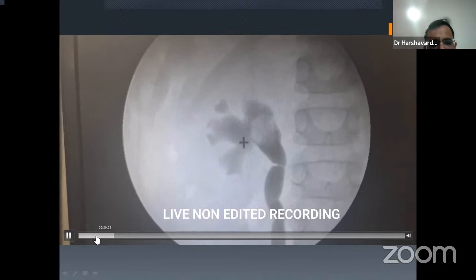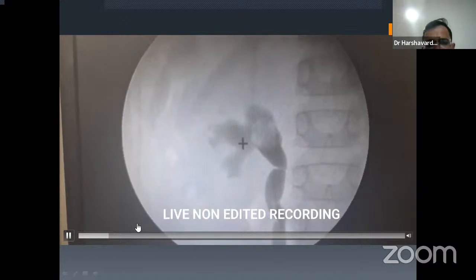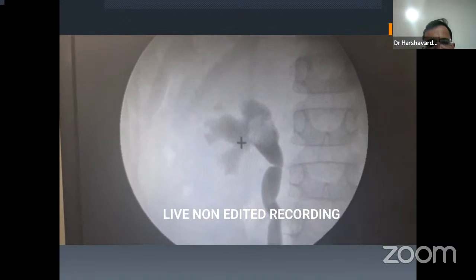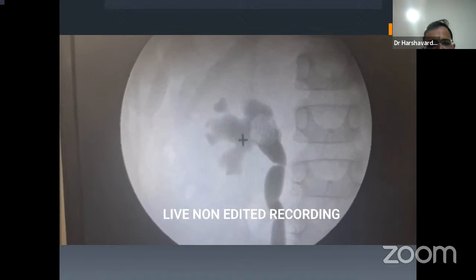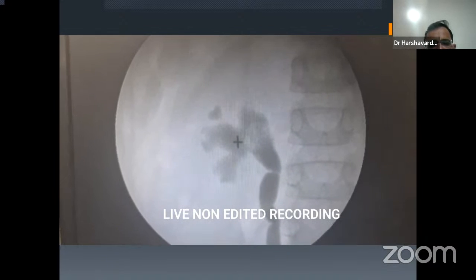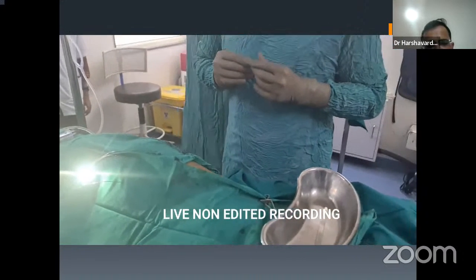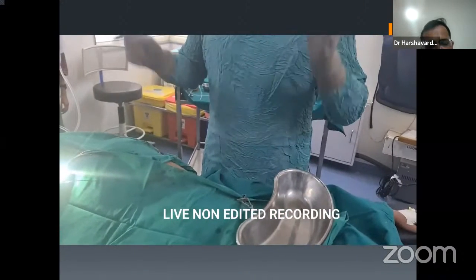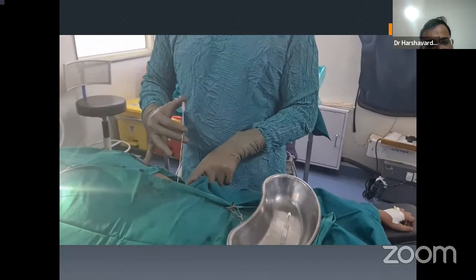So this is an RGP picture. Slowly the system has been filled with contrast. You can see a pelvic stone, with the inferior calyx dilated. It's a 7-year-old boy. Moving the C-arm, I will be directing my needle 30 degrees to the skin surface.